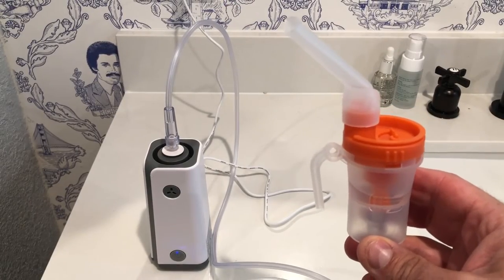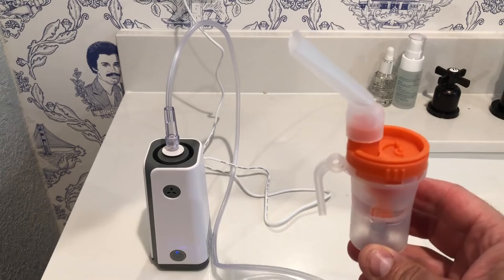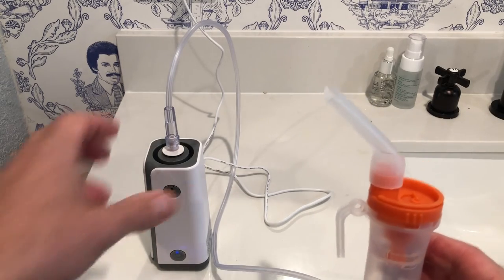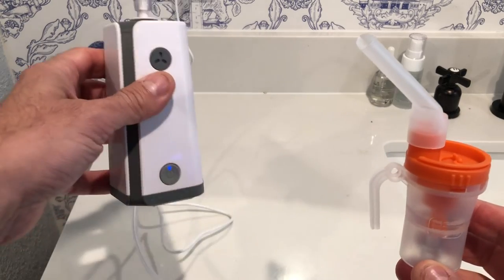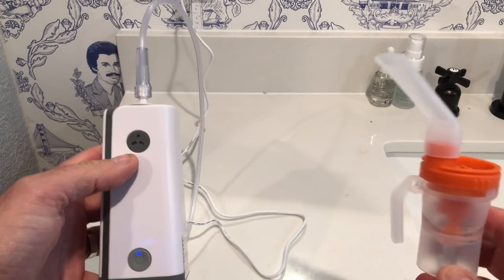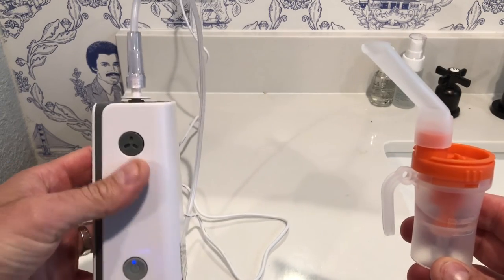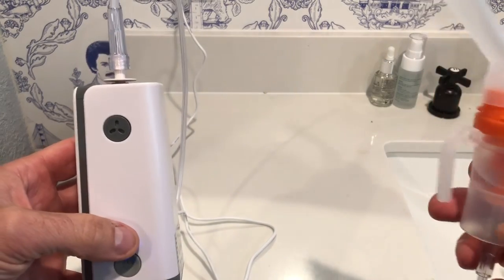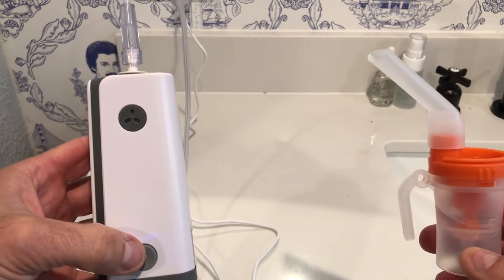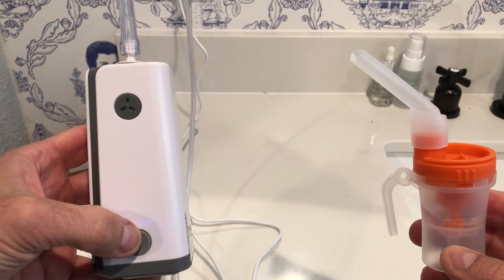Here I am, all set up. I've gone ahead and put a little bit of just water in this cup because I don't have a medication right now. You can see the unit is powered on and I have it hooked up. Once I hit the power button it'll operate — it'll push the air through the hose and it'll mix with the medication, or in this case the water, and you'll see a little bit of the vapor that comes out.